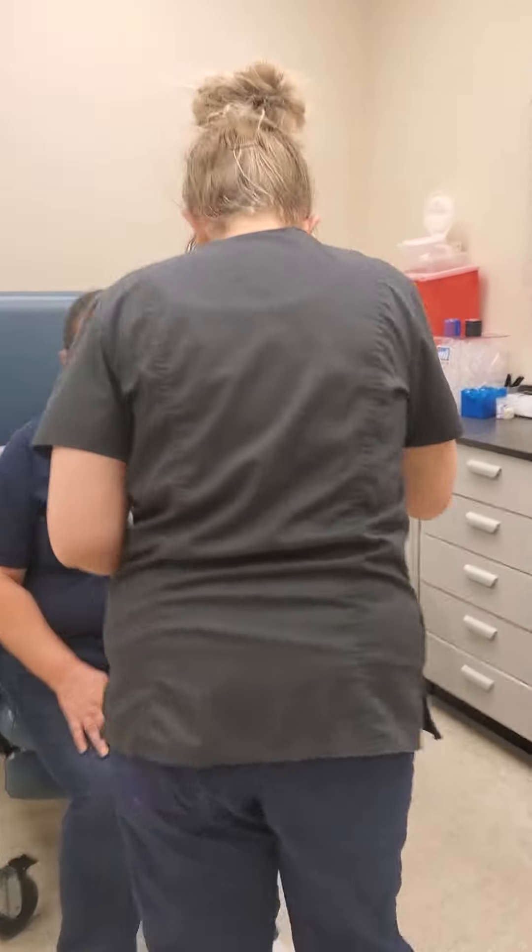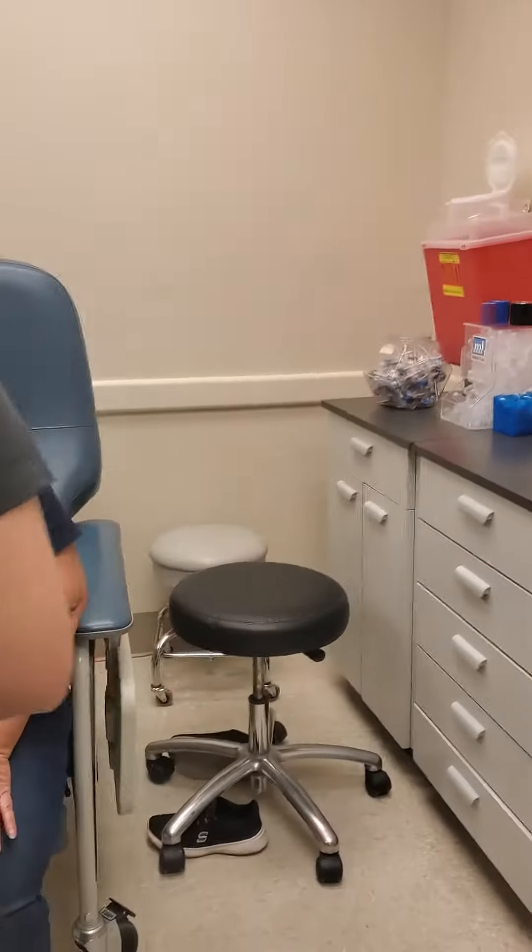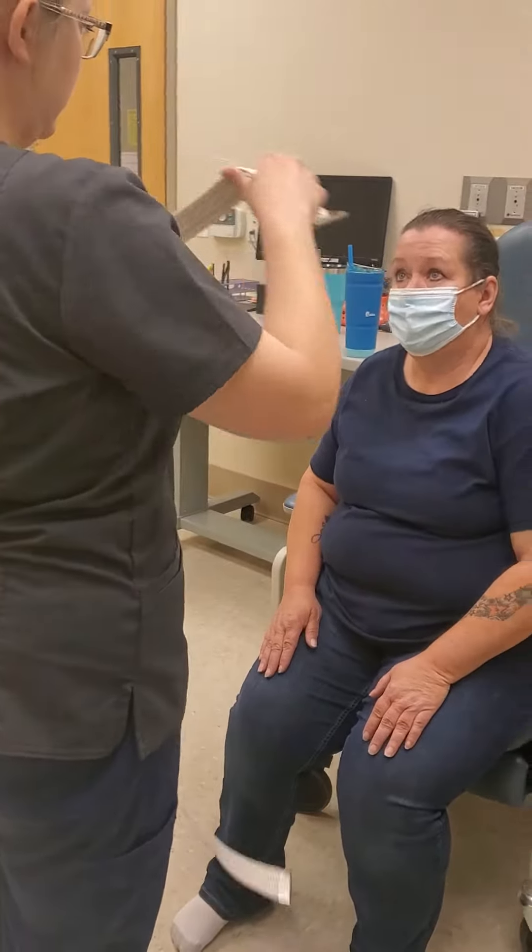Hey, Audrey. Do you have non-slip socks on? I do. And how are you feeling today? Are you feeling dizzy? No.